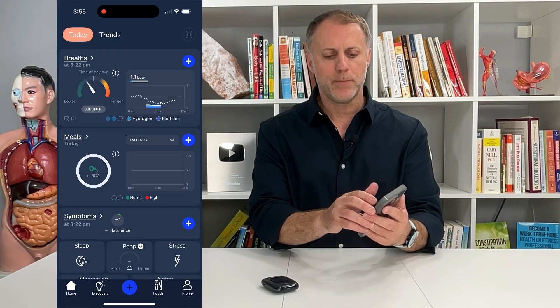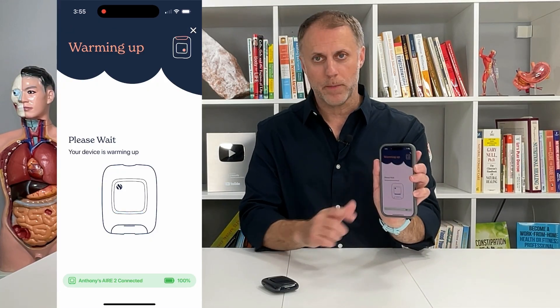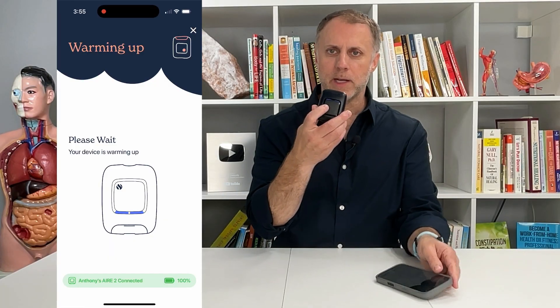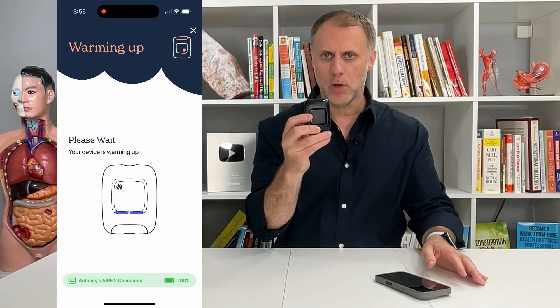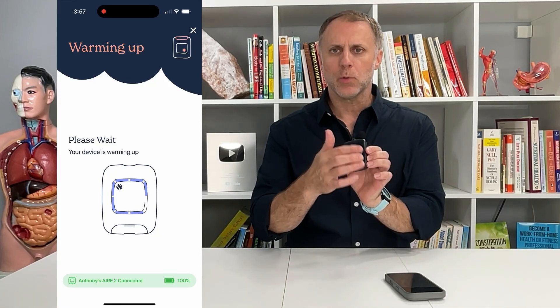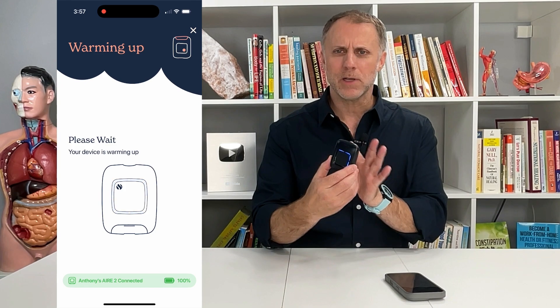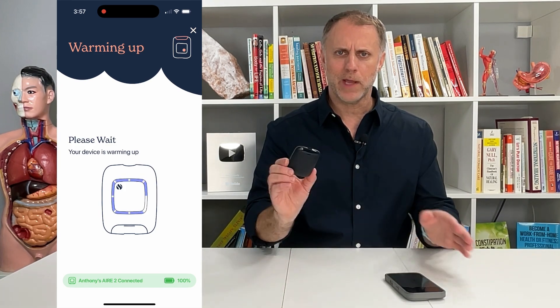When you go in the app and push the plus button to add a breath test, it's going to tell you that your device is warming up. You can see on the device that it only has two lights that are blue, and they'll go all the way around — that's when you'll know it's ready. When all the lights go around it'll buzz a couple times, like that buzzer you get at P.F. Chang's that tells you your table is ready.